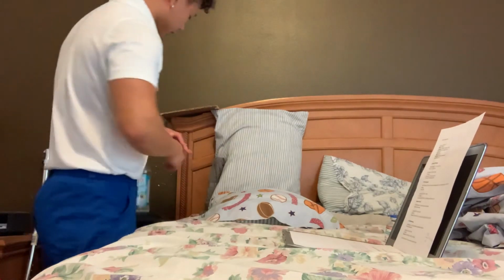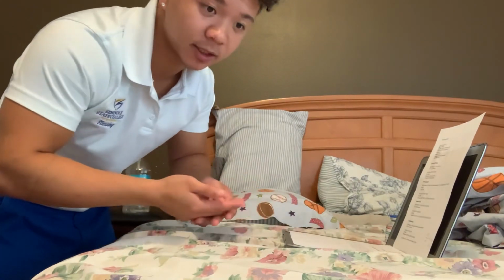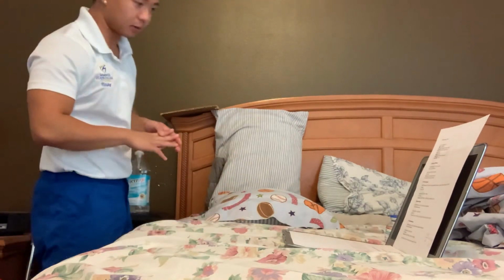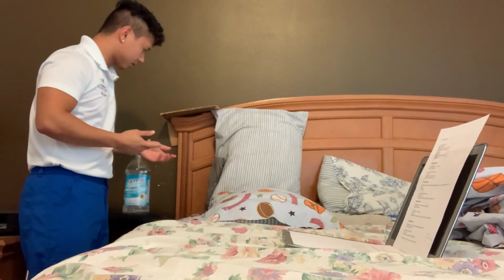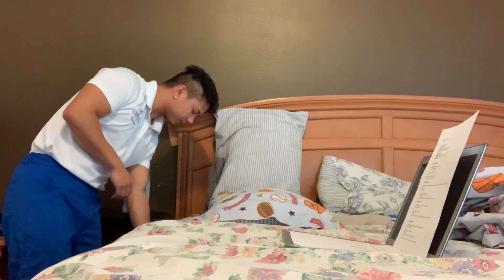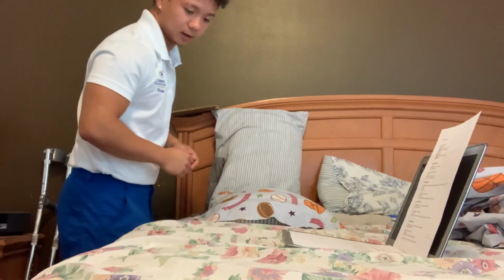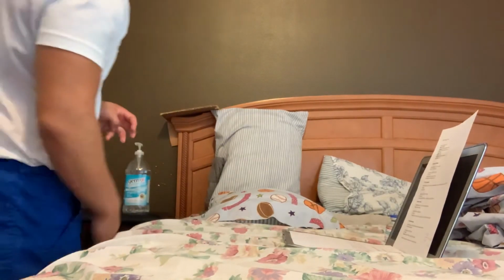And now I'm just going to document that I gave the medication at the deltoid, 0.5 milliliters of influenza vaccine. And I'm going to do any assessments after my administration. And afterwards, I'm just going to assure safety. So bed is in the lowest position. Side rails are up. Call lights in reach. And I'm going to check the brakes. So the bed brakes are on.